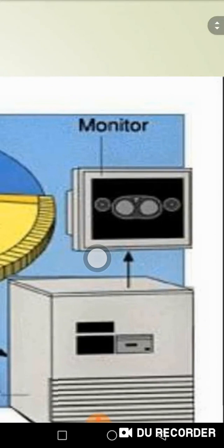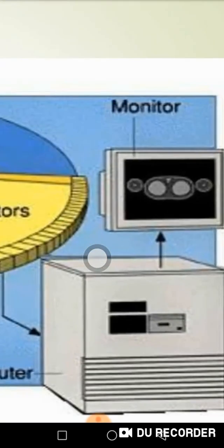Simply put, if there is no absorption, or if the exposure remains very high, the signal translates to black in the image. So, to understand this, when the signal I receive, the intensity of the photons or X-rays, comes to me strongly or with high intensity, it must be represented in black. For example, in the image you see here, the gray or brown color represents details present in the image, while the surrounding area, what is that? It's the air. Why did it appear black here? Because the air did not absorb any radiation, so it appeared black.